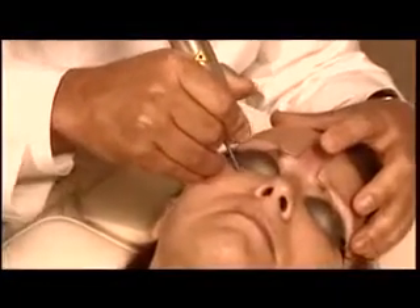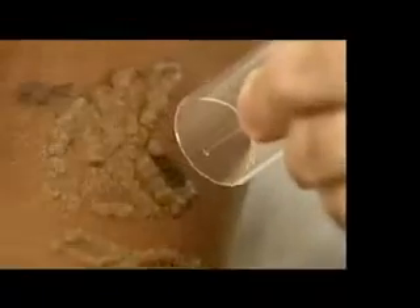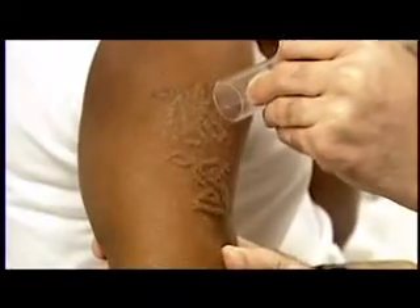What's unique about the Revlite laser is that you can treat all skin types. You can treat the lightest skin types knowing you're doing a good job and it's safe, and you can treat the darkest skin types knowing it's going to be safe and effective.